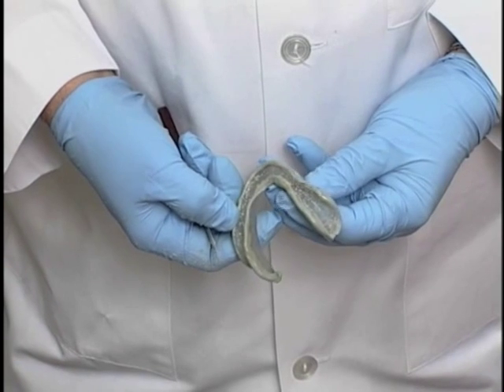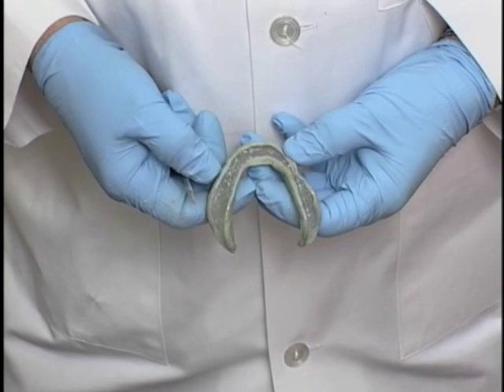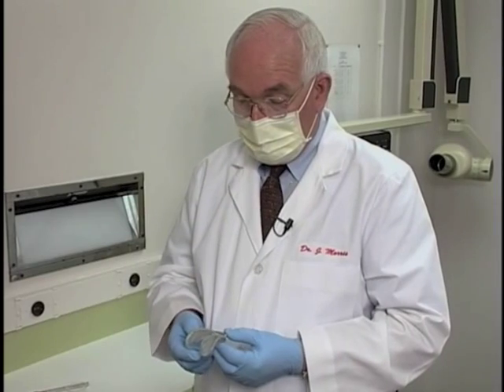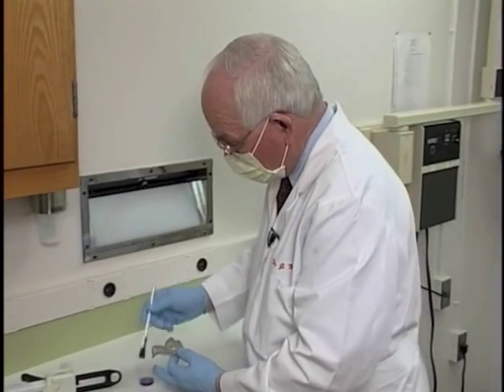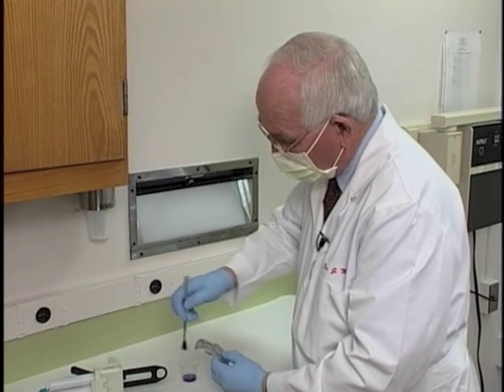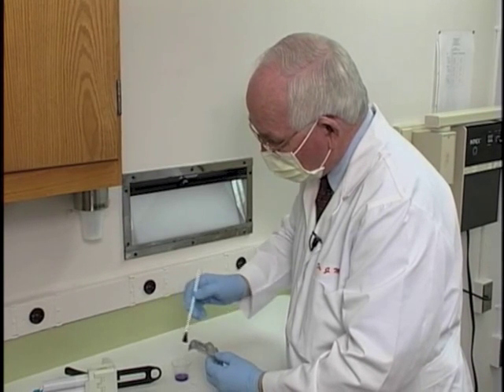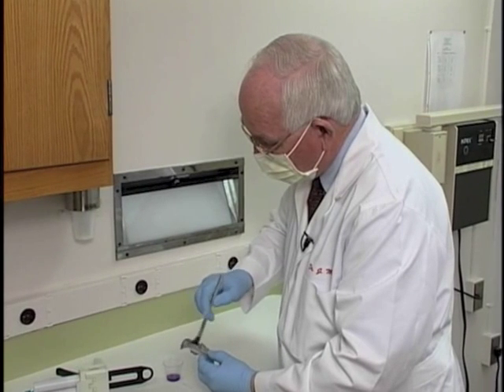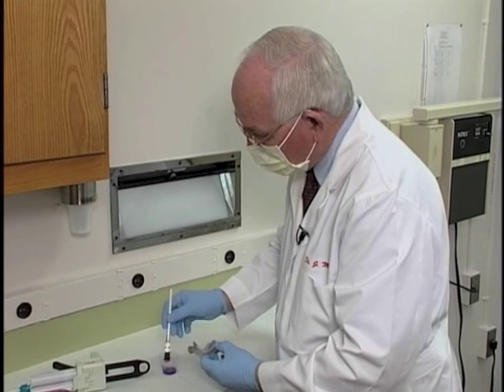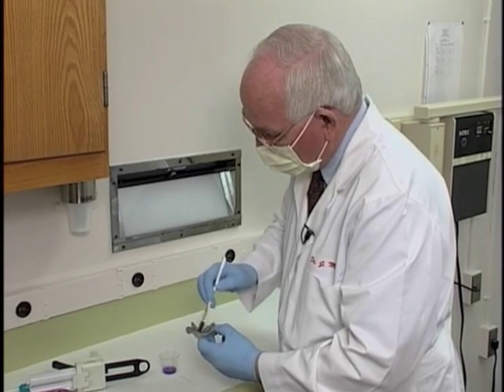And now our tray has been trimmed, the compound's been trimmed, and at this point we're ready to apply an adhesive to the tray in order to make our final impression. Now we're ready to paint our tray with the adhesive. As we paint it, we're going to paint all the internal surface of it with the adhesive. In addition, we're going to make sure that the adhesive is applied not only to the tray, but to the compound also, because the material needs to stick to the compound as well as the tray in making the impression.